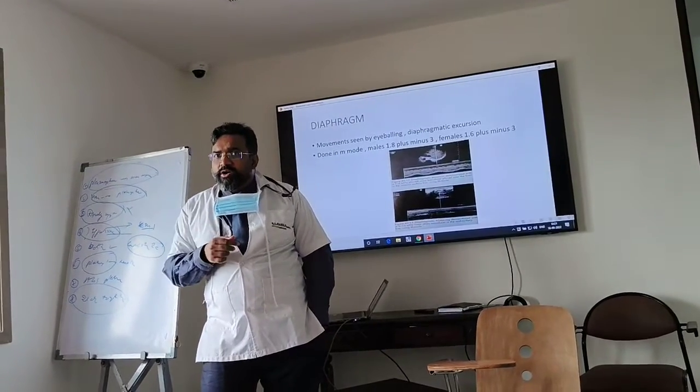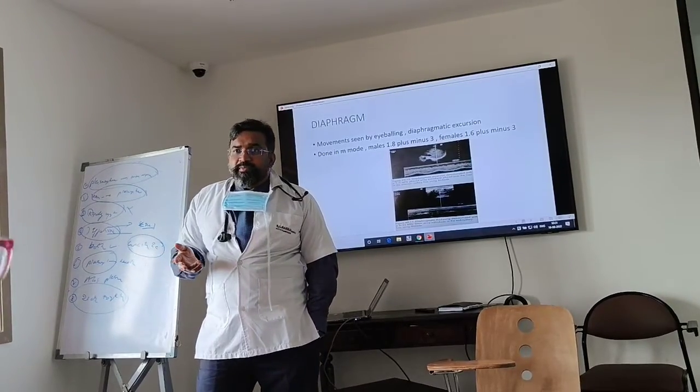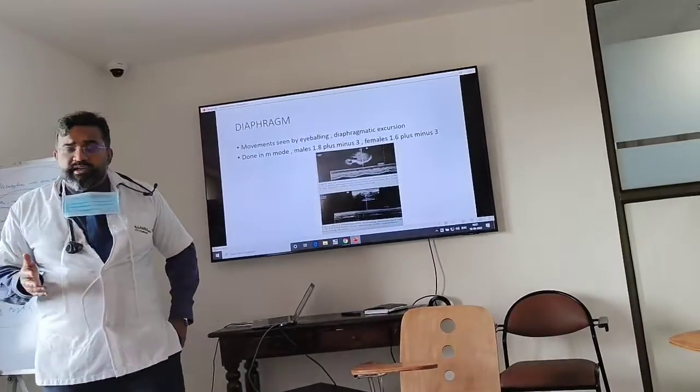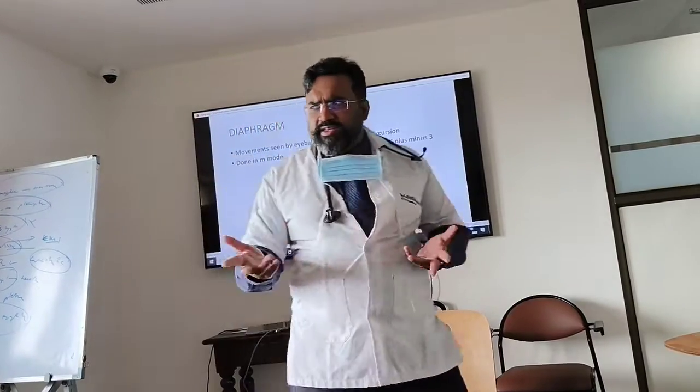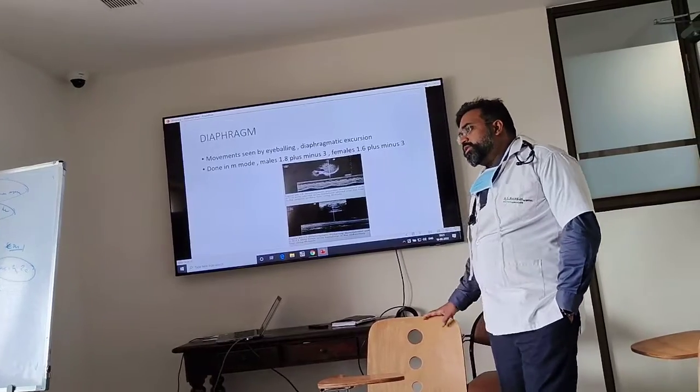As the diaphragmatic thickness is not okay and diaphragmatic excursion is not okay, this patient has got a high chance of getting intubated. You understand? That will come to your mind already. Like we don't have forced vital capacity, we don't have NIF, we don't have anything, right? So this will probably help you to understand whether this patient will require intubation or not.